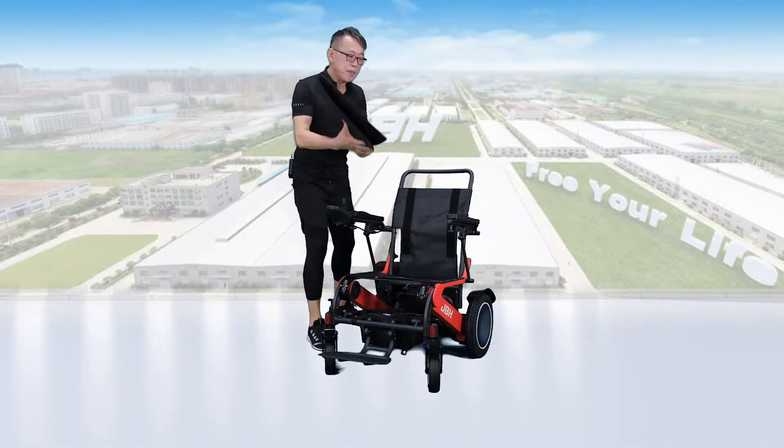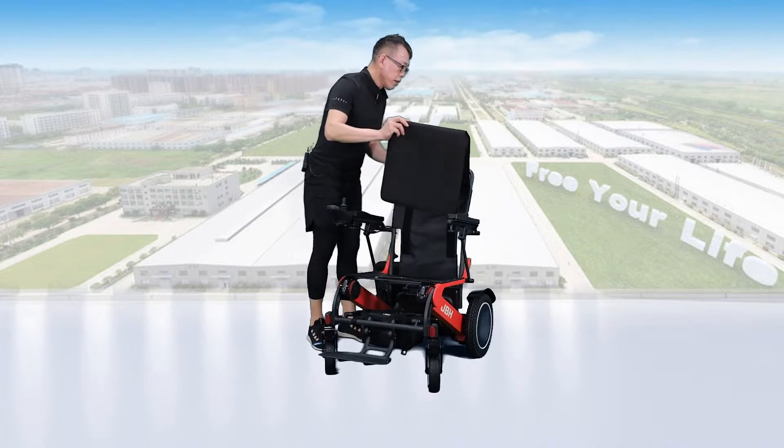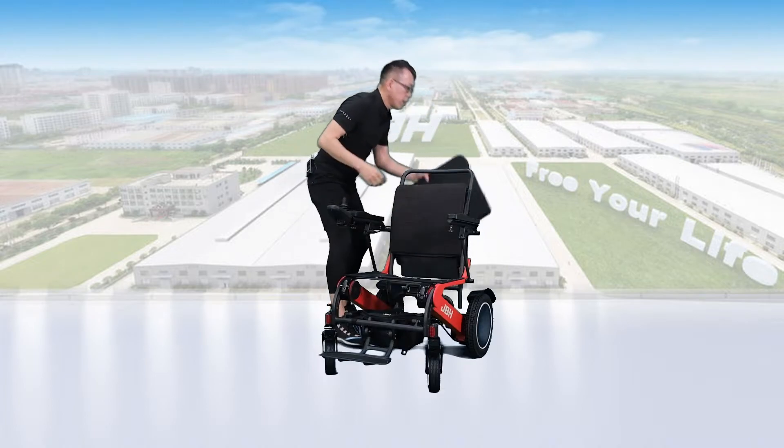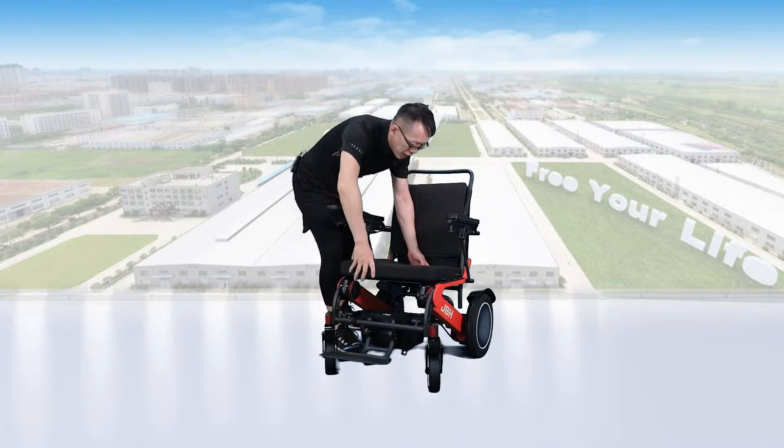Next, for the seat back, we need to put the cushion here, and a seat cushion on top of the seat.